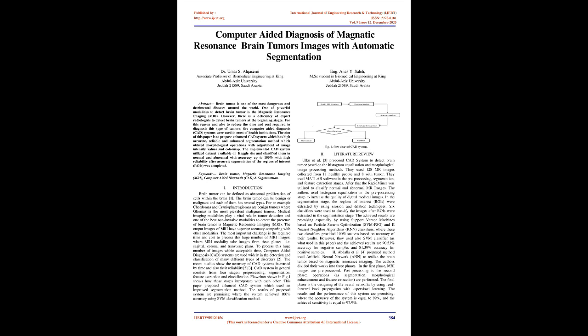However, there is a deficiency of expert radiologists to detect brain tumors at the beginning stages. For this reason, and also to reduce the time and cost required to diagnose this type of tumors, computer-aided diagnosis, CAD, systems were used in most health institutions.